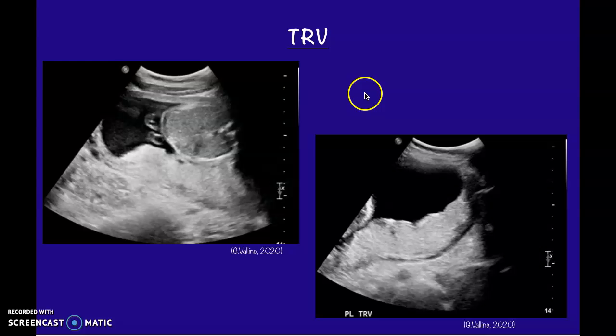These are my transverse pictures. For this one, we can see that edge of the placenta, some of that body. And then in this image, we see that body really well, and then we can see the edge. I was able to stretch the placenta out and get it in 2 images, which is okay. Again, we see that amniotic fluid, we see baby, placenta, and the uterine wall. And again, I would change the gain on all of these images.